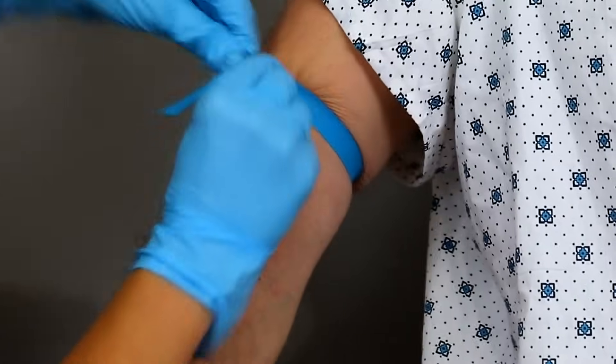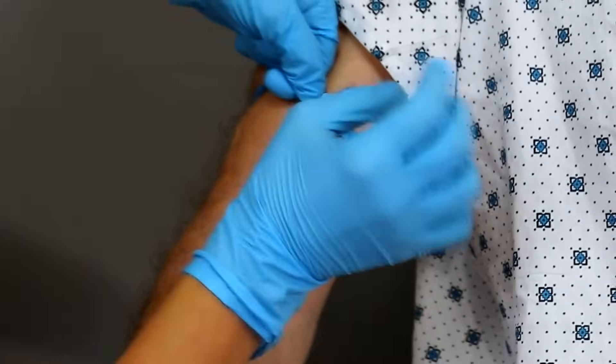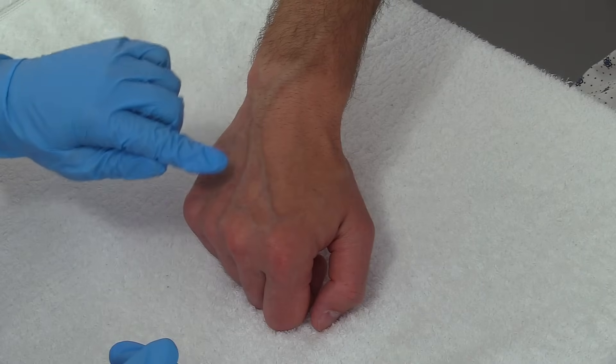So now I'm ready to insert the IV and I've applied the tourniquet. The vein that we're going to go into is in the hand — we're going to go right there.